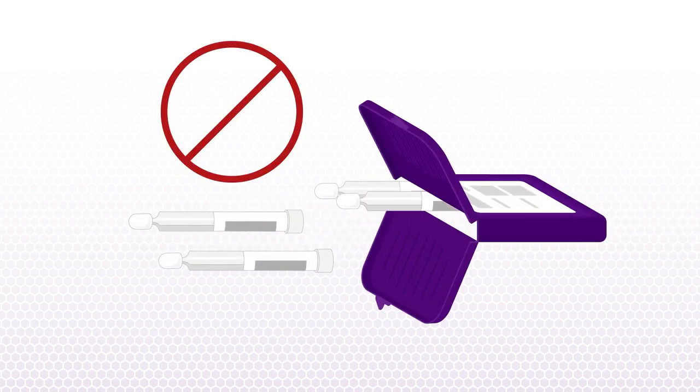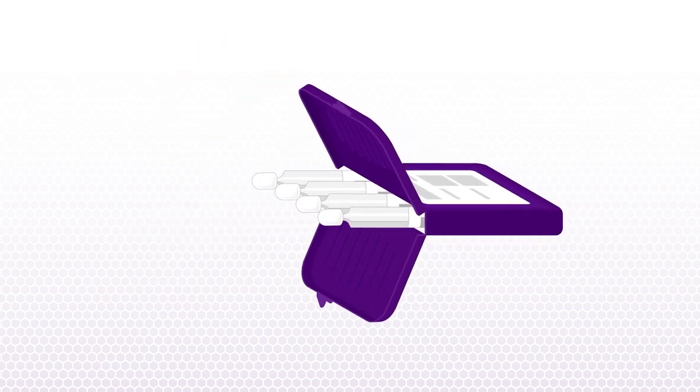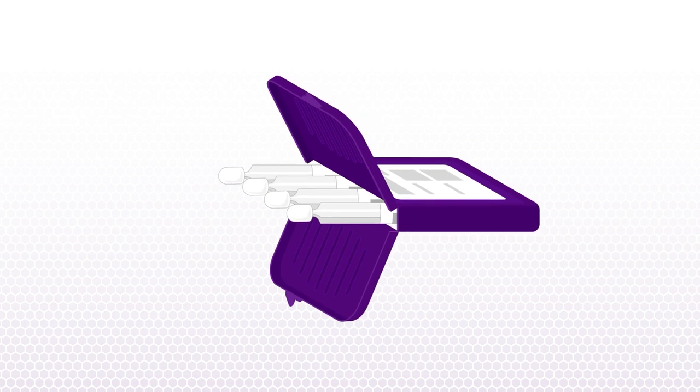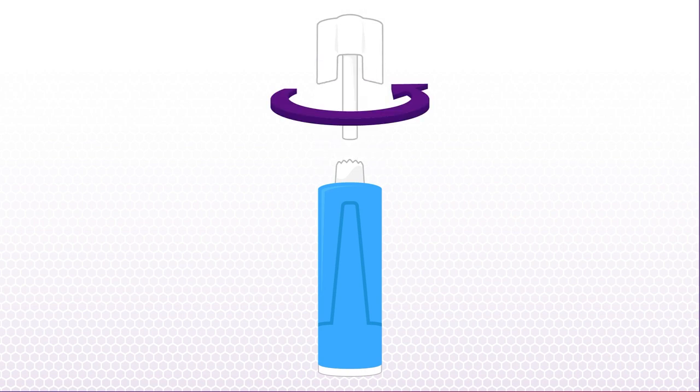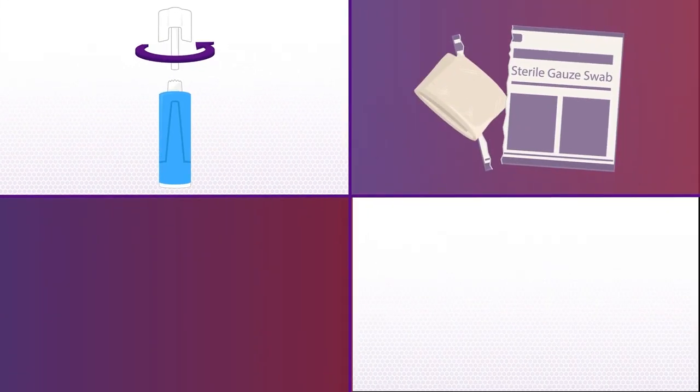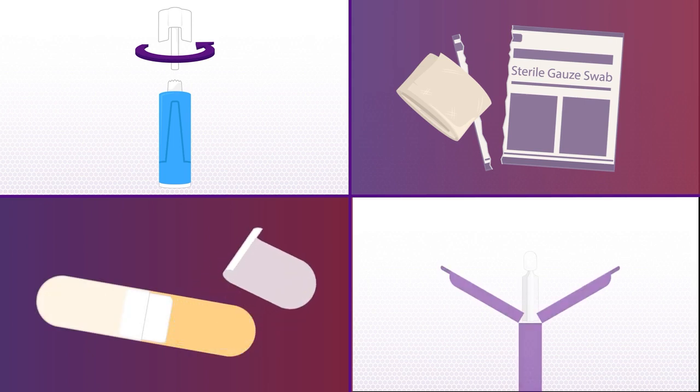Do not remove the samplers from the device. Those remain in the device during blood sample collection. Please note that depending on the kit you received, the device may contain four or two samplers inside. Twist the caps off the lancets, remove the gauze from its packaging, unpeel the backing from one side of each bandage, and have your Mitra device ready.